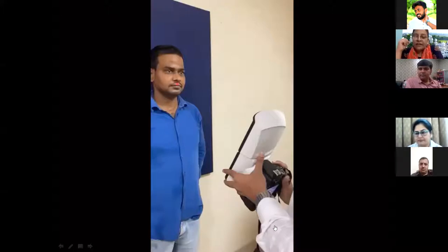And when we were thinking that for our surgical cases we need to have something smaller, we had the options of facial scanners from InScan, as Dr. Sumit just talked about, or 3DMD, which I talked about, where the entire room had to be set up, or the Vectra 3D. This is just a portable small camera, and Dr. Swati also showed yesterday how we need to focus, how we need to place them, and then pictures can be taken, maybe three images, and then they are stitched together. Over to you, Dr. Sumit.